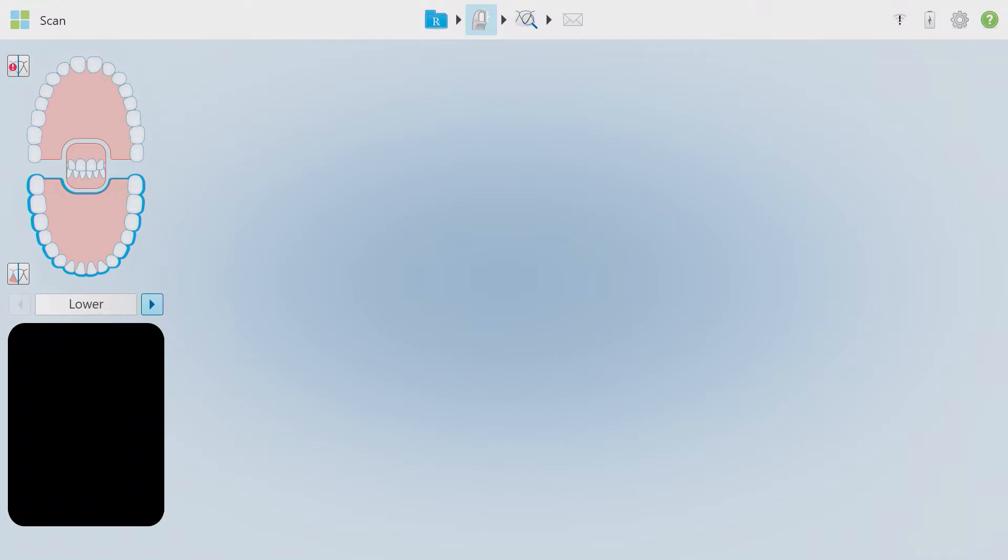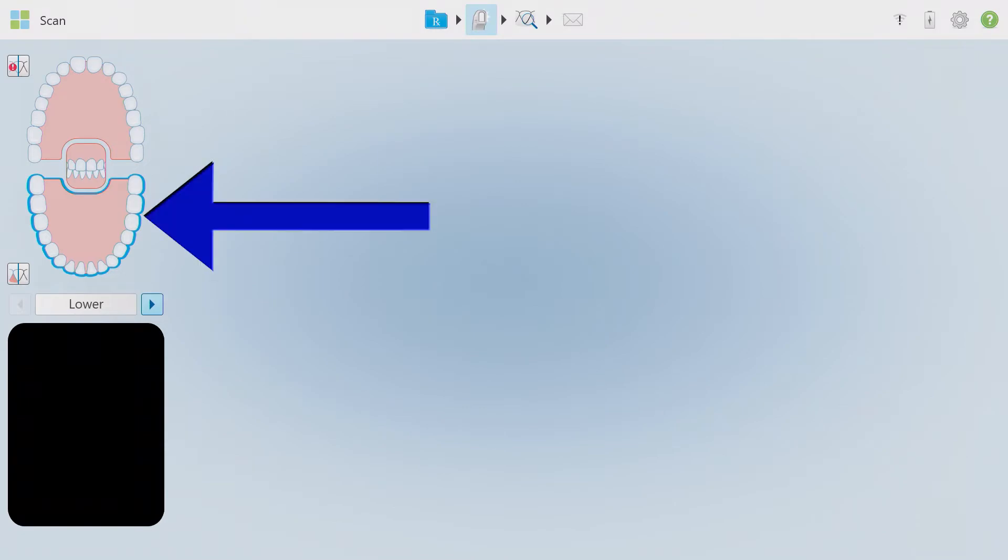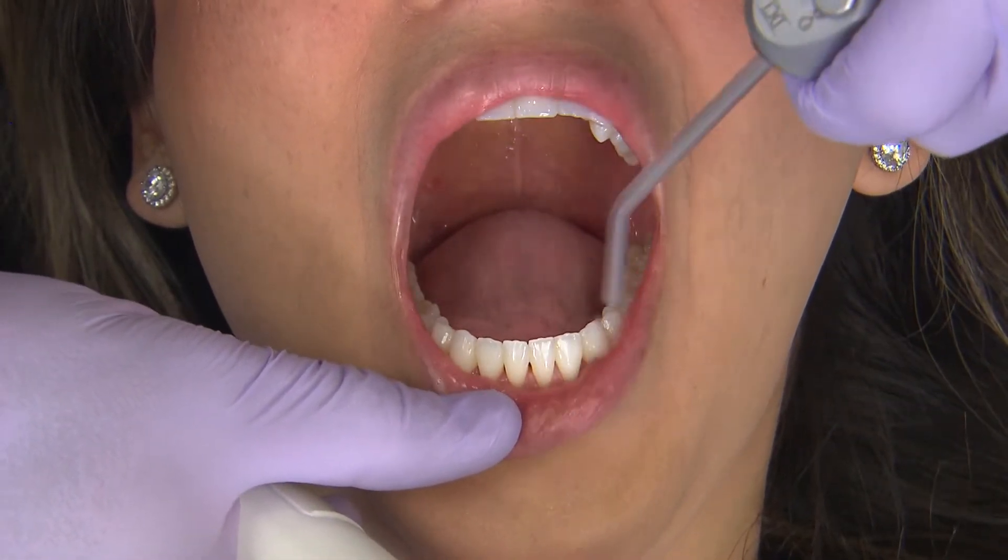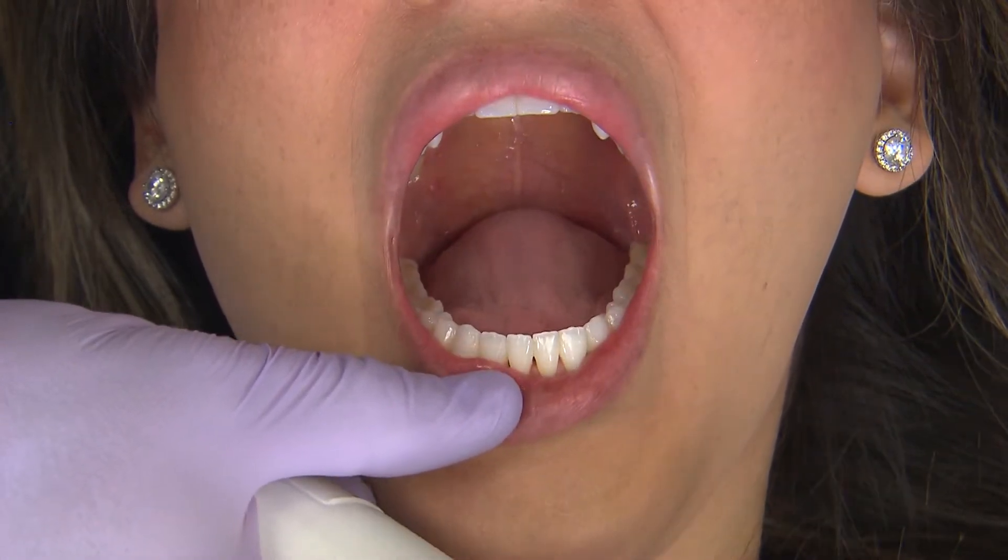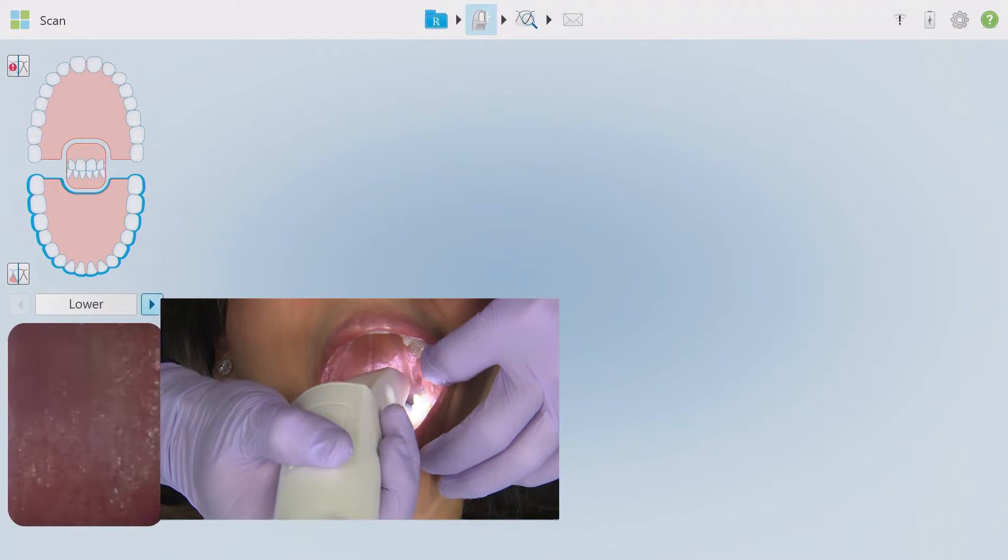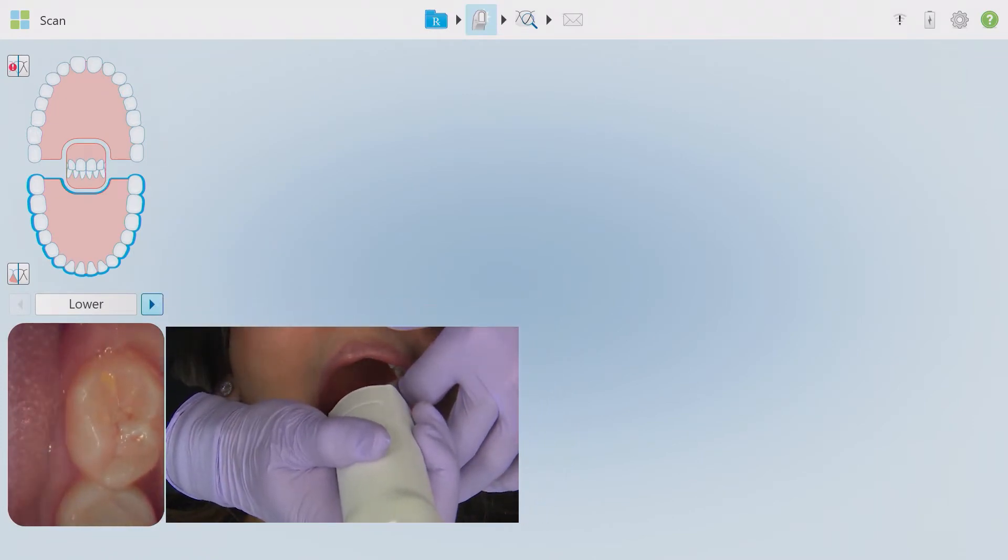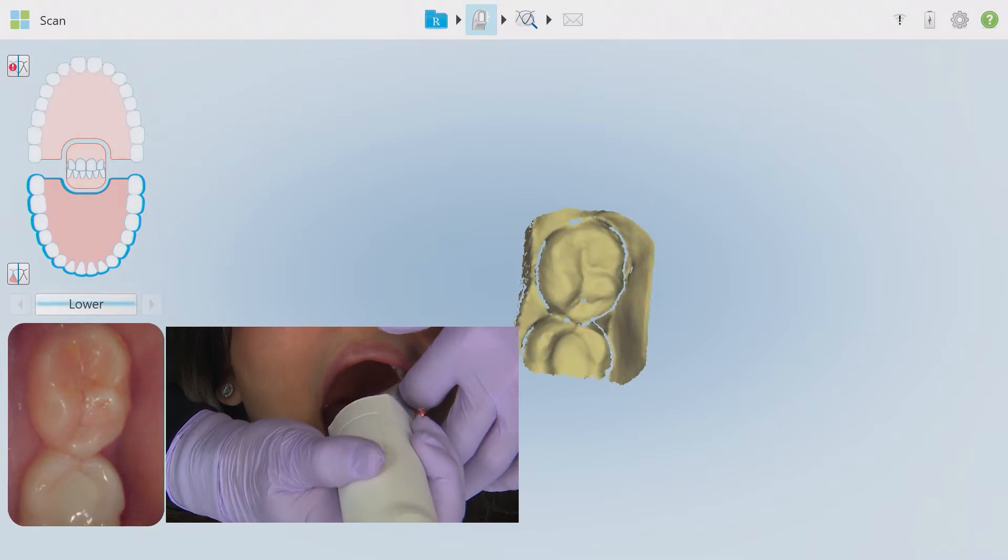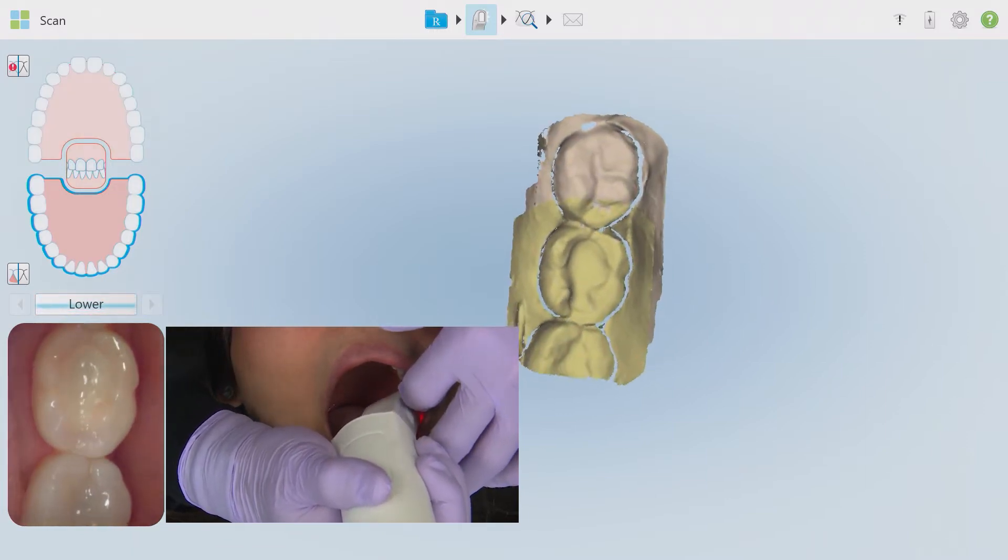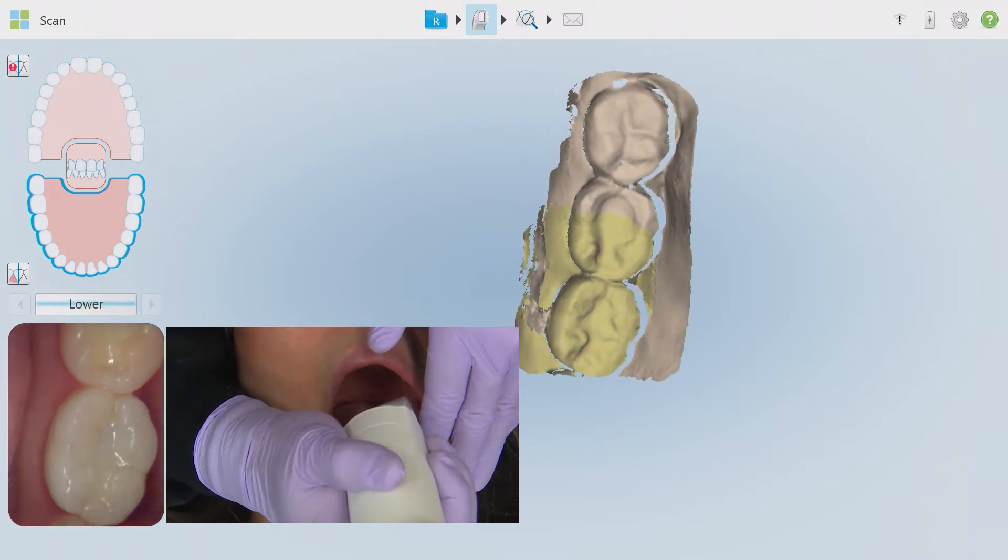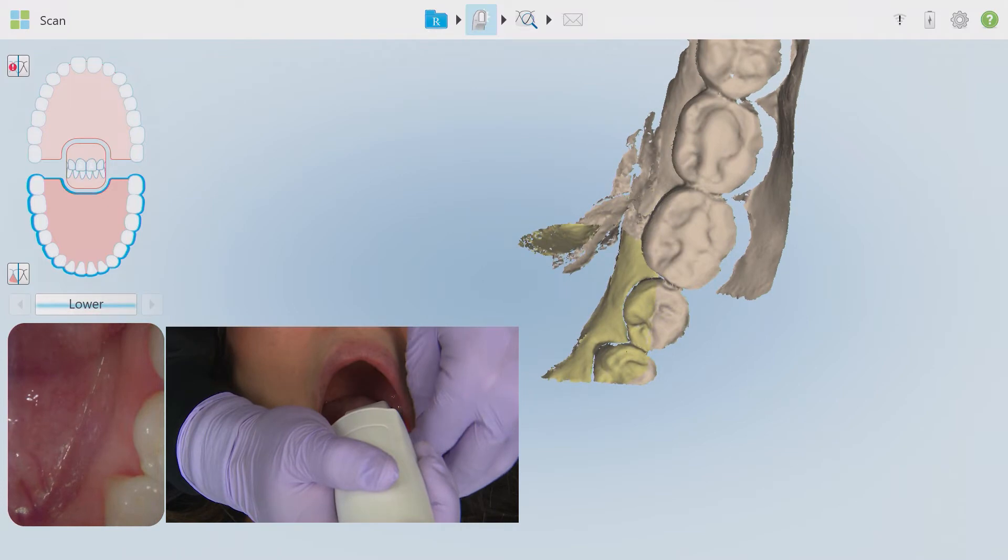I typically choose the mandibular arch to begin a full mouth scan, similar to the reasons why we start with a lower full mouth impression, and this is to simply build the patient's confidence in the process. As you can see, I have the lower arch selected on the left hand menu. I did this by just pressing on the image of the lower arch. Saliva bubbles and any debris can be removed with an air blast and continued throughout the procedure if you need to. Starting distal to the most posterior tooth in the arch, I'm going to initiate the scan by tapping on one of the buttons found on each side of the wand. On this first pass, I'm attempting to acquire occlusal records only. This patient does have both third molars present, so it's really up to you which side to begin with and feel the most comfortable.